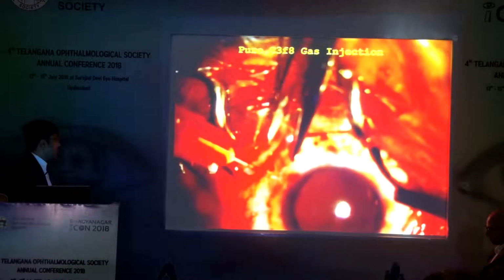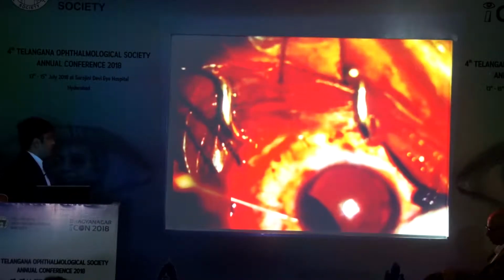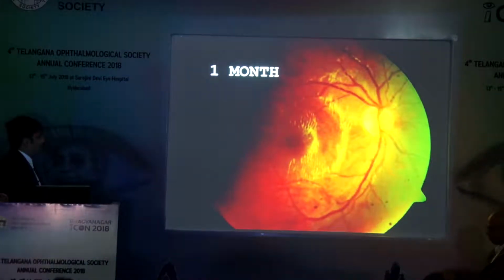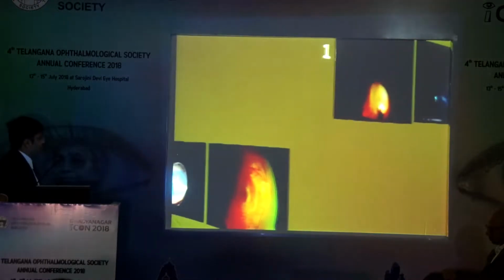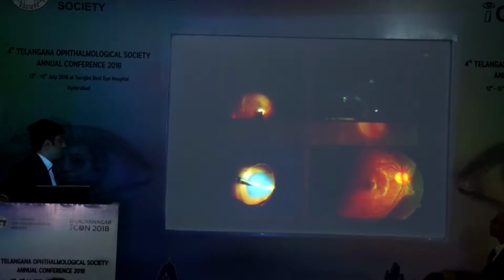0.3 ml of pure C3F8 gas was injected, and the patient was advised strict prone position. At 1 month follow-up, subretinal hemorrhage was noted to be displaced. This video thus shows various rare complications that occur during vitreoretinal surgery and novel ways of managing them successfully.